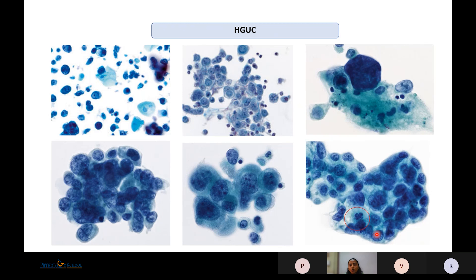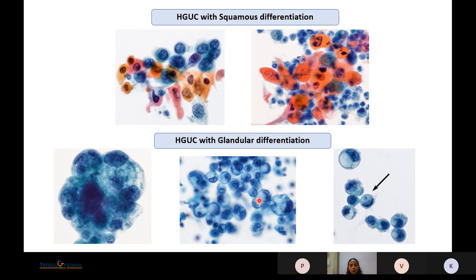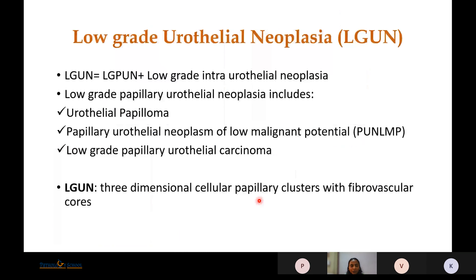High-grade urothelial carcinoma can show squamous differentiation with keratinized cytoplasm and atypical large hyperchromatic nuclei, or glandular differentiation with clusters or singly scattered cells showing focal glandular differentiation. These should be labeled as High-Grade Urothelial Carcinoma with squamous differentiation or High-Grade Urothelial Carcinoma with glandular differentiation.